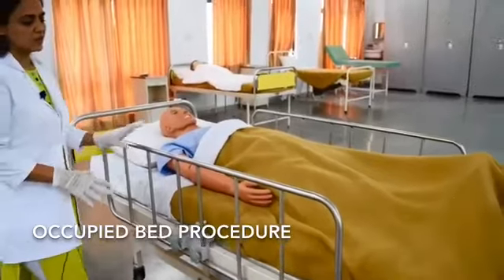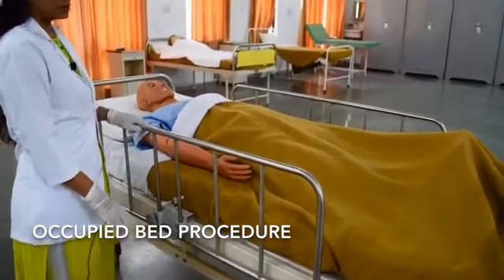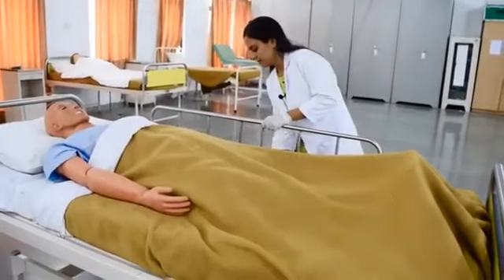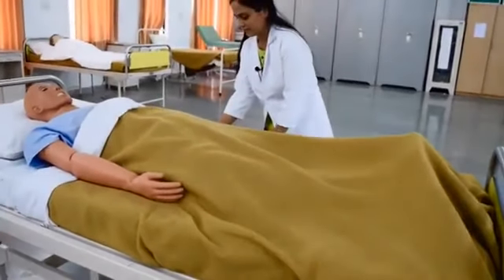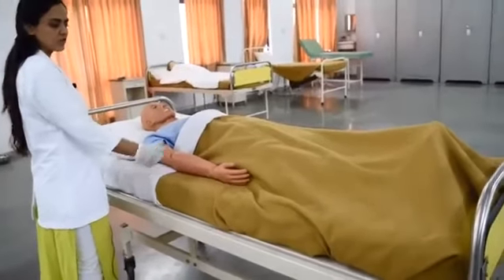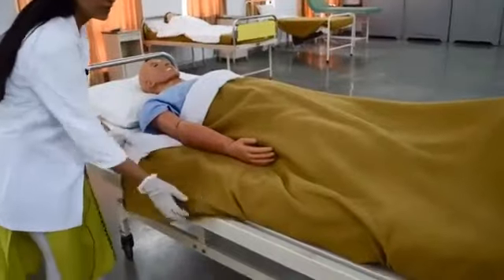First of all, the railings we have to push down, right, on both sides. Here also we will put down these railings. Now we have to loosen these linens from both sides. So one by one we will loosen this.